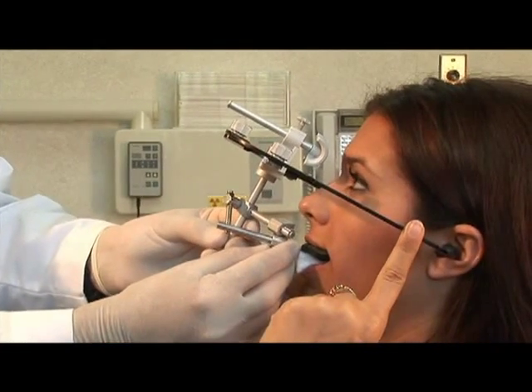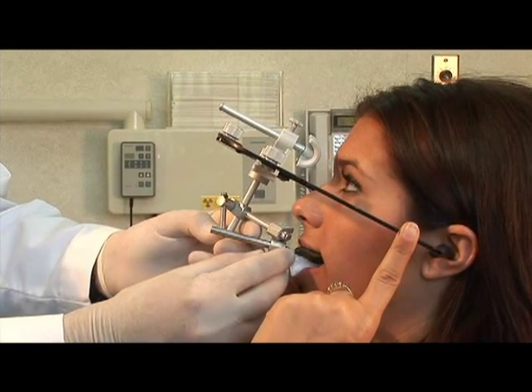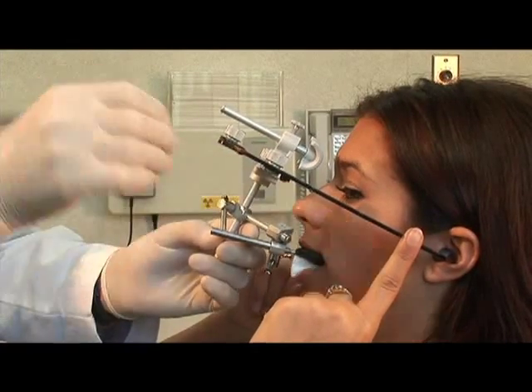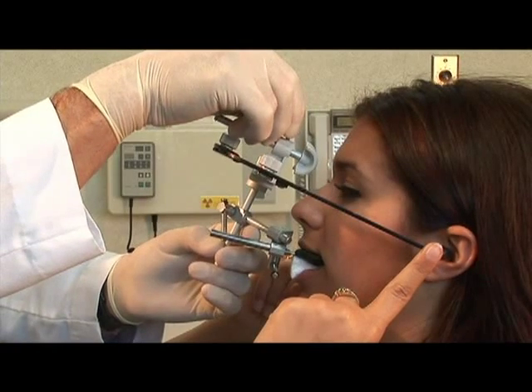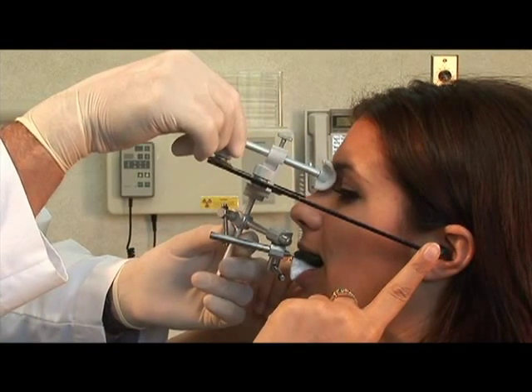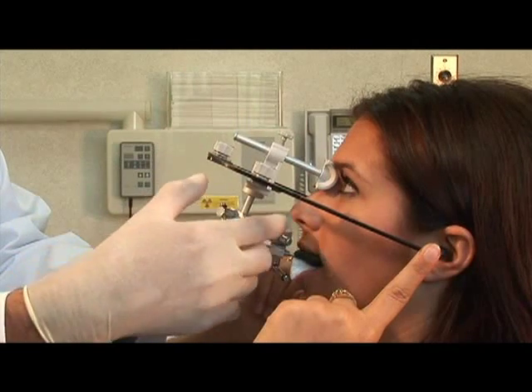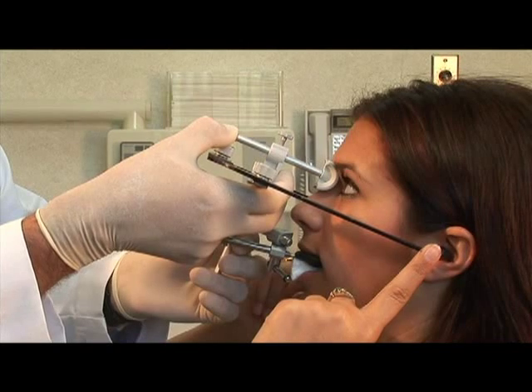Great, just one finger, that's super. Okay, just a little lighter there with your pressure. You don't want very much pressure. And let's move your hand back here towards your ear a little bit closer. Good. All right, this piece is going to fit right against the bridge of your nose. Make sure you keep your teeth closed against that cotton at all times for me. When you feel a little pressure here, I want you to push in at your ears just slightly.